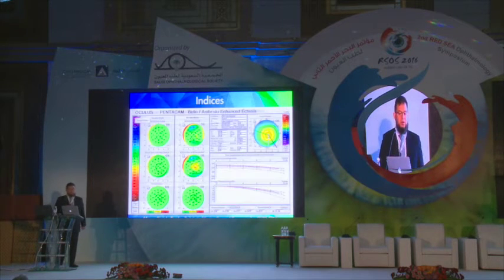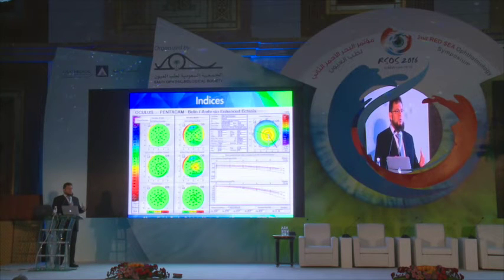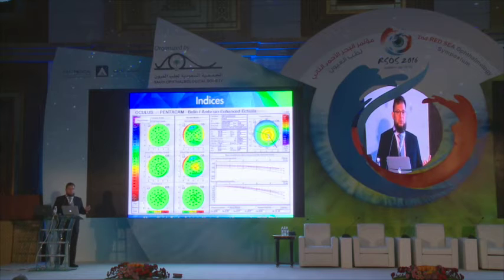The same for the Belin-Ambrosio display, because this display, although it is very important, is not 100% specific, not 100% sensitive. So we have false positives and we have false negatives.